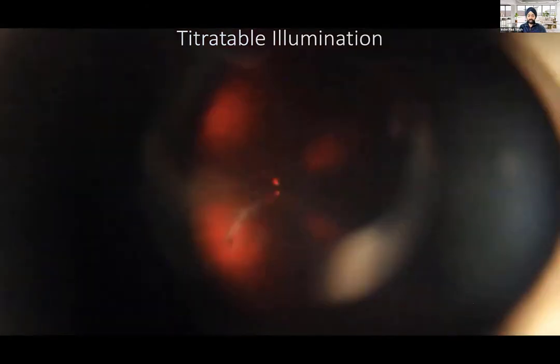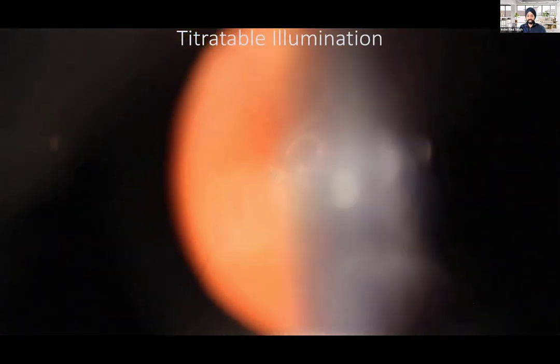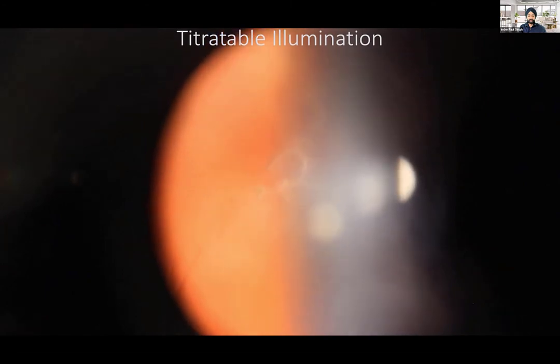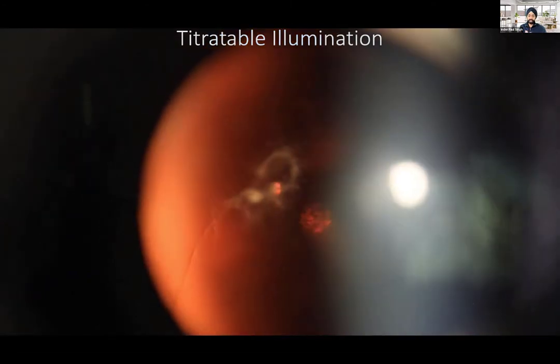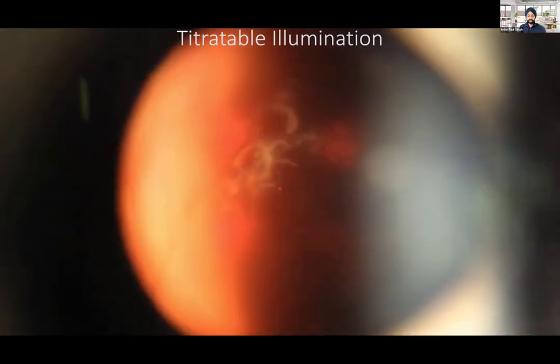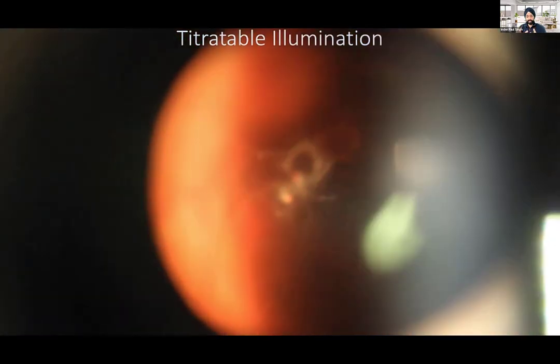Here I'm using my titratable illumination with a slit lamp in the oblique position, showing that there's a floater. As I go coaxially, the floater looks a little blurred. It's hard to see because there's so much glare. So I'm going to move the slit lamp oblique about 15 degrees to get rid of some of the anterior glare. I can see I'm still far enough away from the retina, so this is really a middle of the vitreous opacity. There's the lens capsule, and now you see I'm pretty much in the middle of the vitreous, far away.